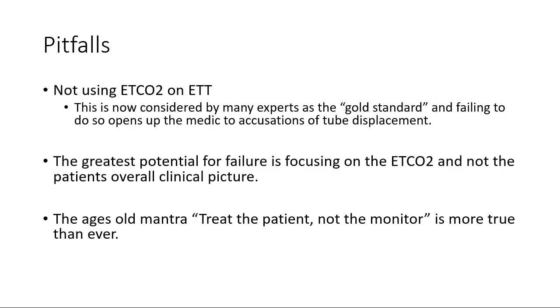So that brings us to the end. I want you to remember the big pitfalls. Number one, do not intubate patients without applying an end-tidal CO2 immediately afterward. It's the gold standard. And if you want to be pro-level, super-duper paramedic, get an end-tidal CO2 reading on your BVM beforehand. The greatest failure is focusing on end-tidal CO2 and ignoring the clinical picture, or vice versa.